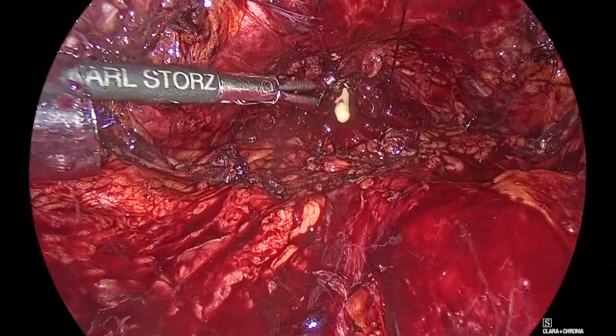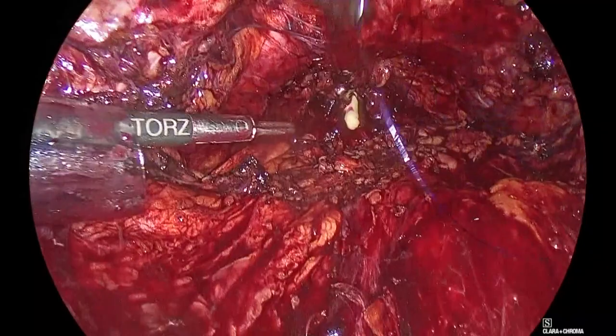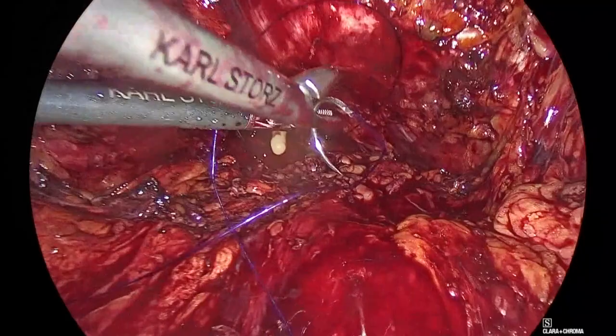So this will actually fix itself. Good. Leave it down now. Needle. So it's one on the bladder, but we will pass a second one on the bladder also, a second bite on the bladder to have a firm grip on what we're doing here.